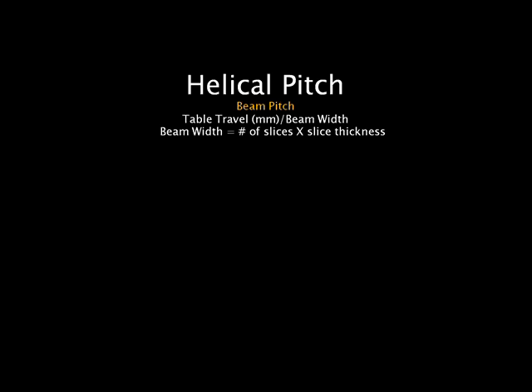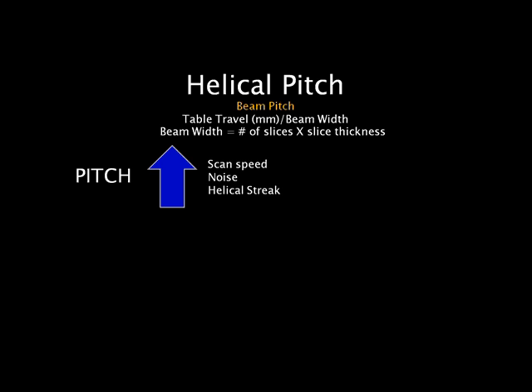What does this mean? Well, if you increase the pitch, you're going to increase the scan speed, but you'll also increase the noise and helical streak artifact. This lowers the radiation dose, but it's also going to lower the image quality.